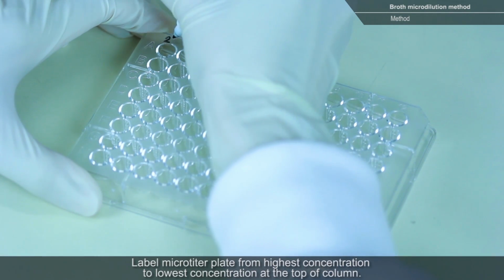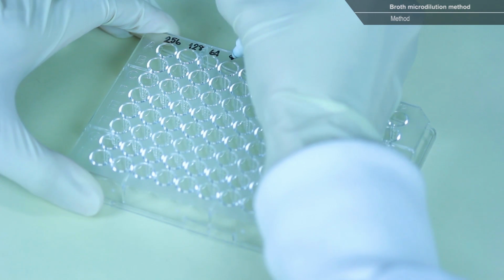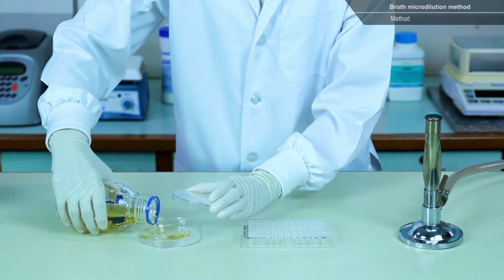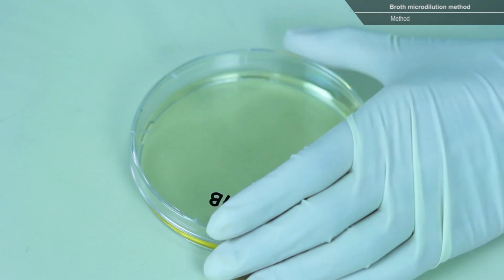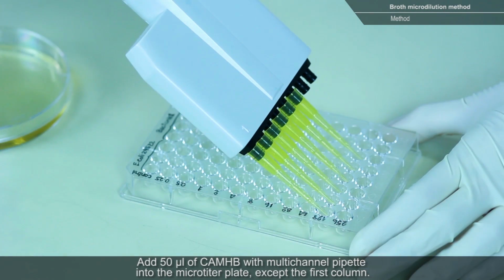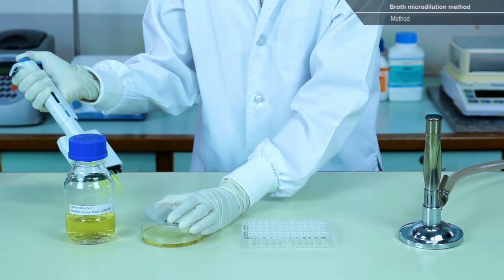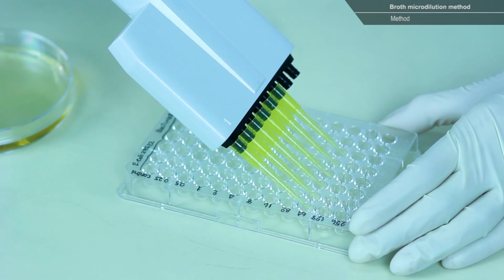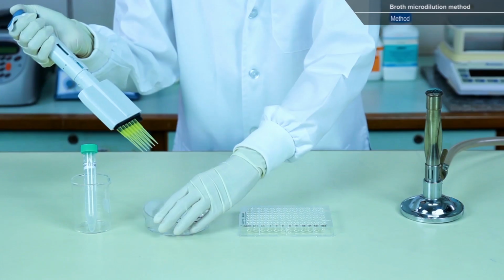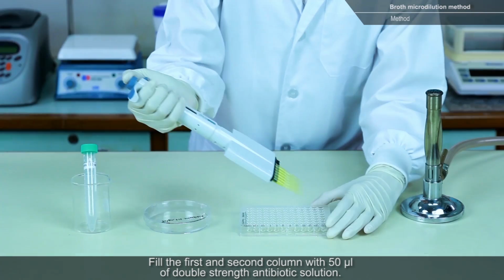Label microtiter plates from highest concentration to lowest concentration at the top of the column. Add 50 microliters of cation-adjusted MHB with a multichannel pipette into the microtiter plate except the first column. Fill the first and second columns with 50 microliters of double-strength antibiotic solution.